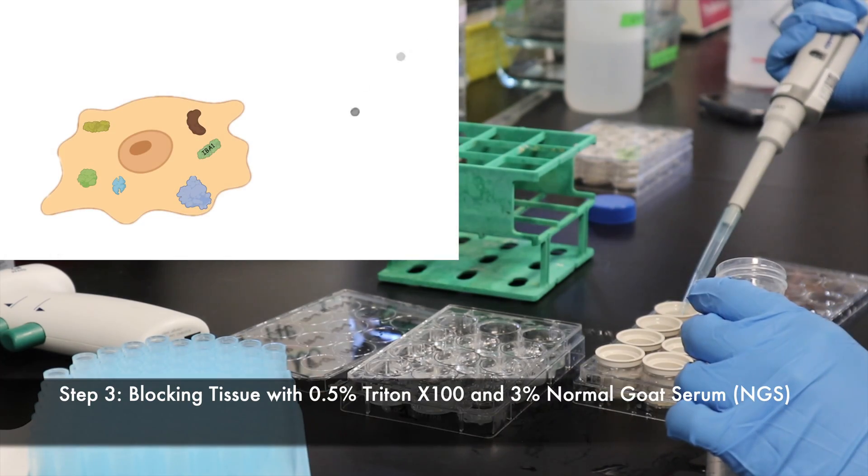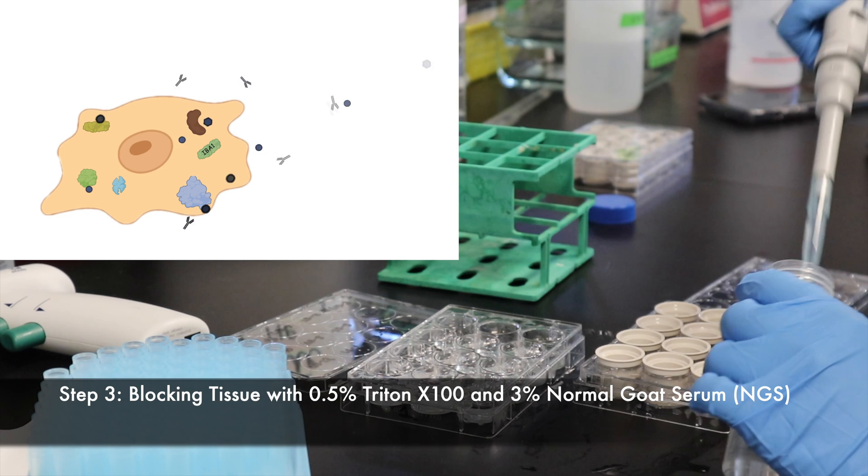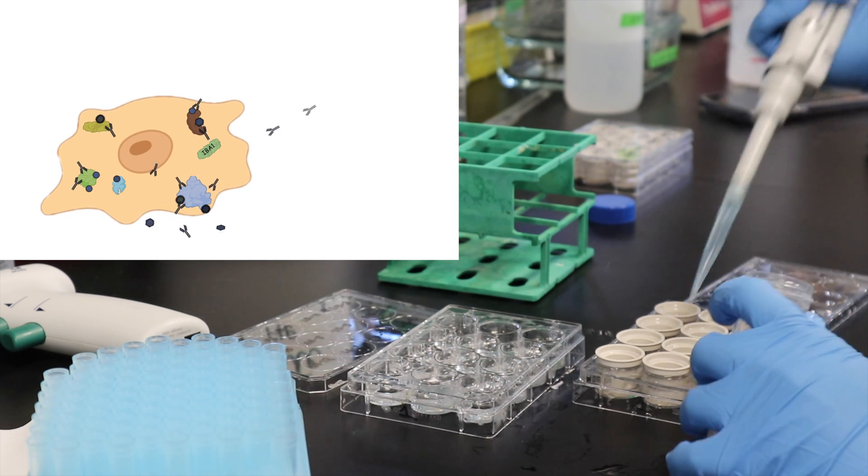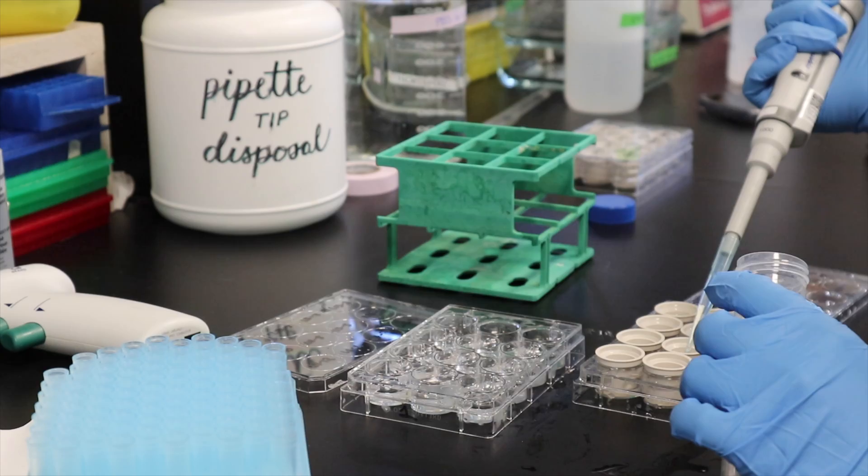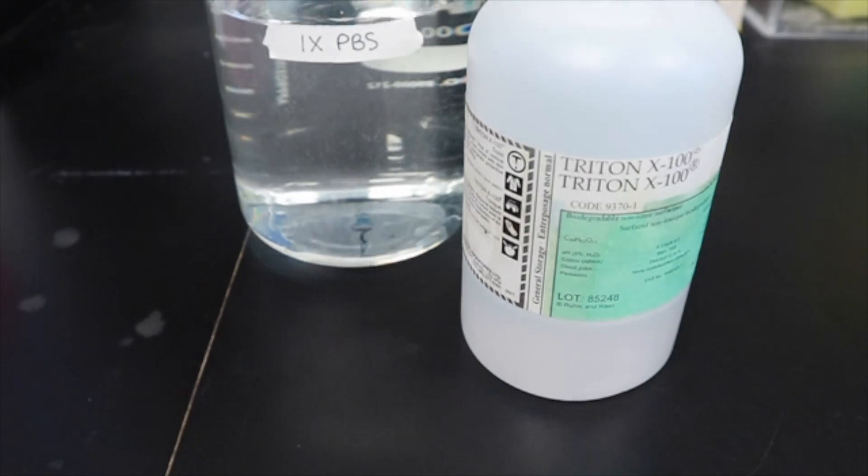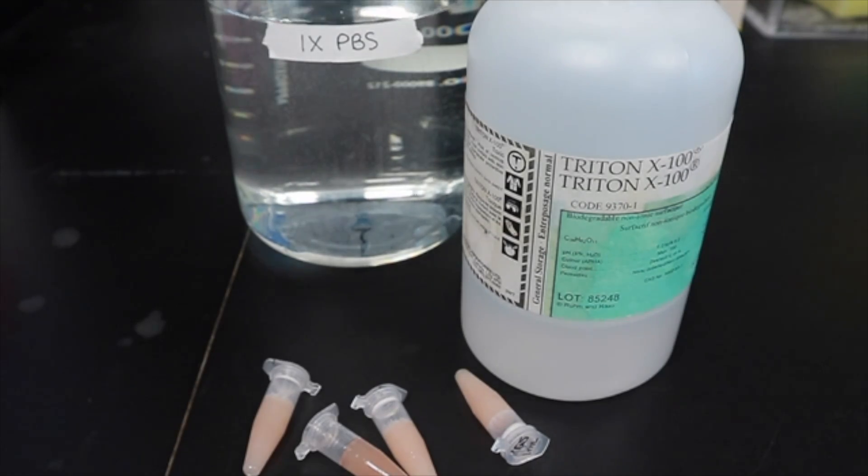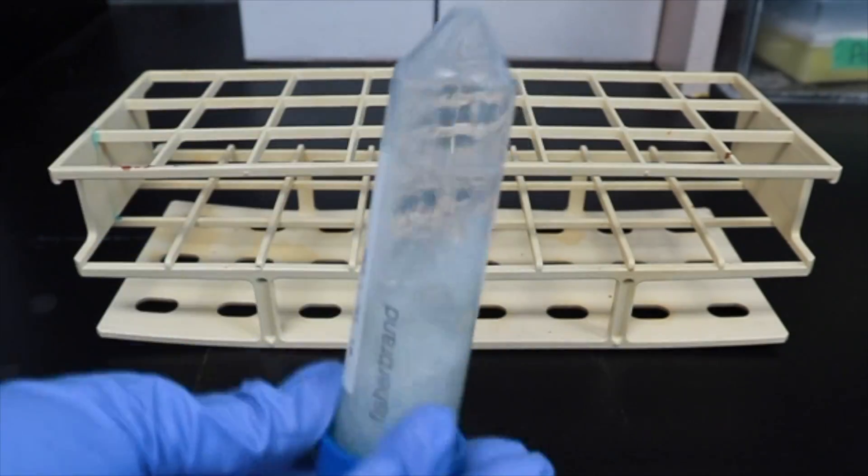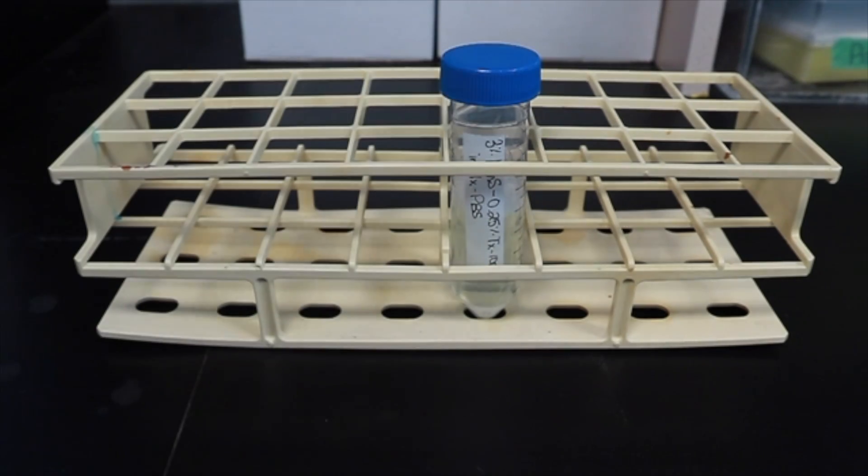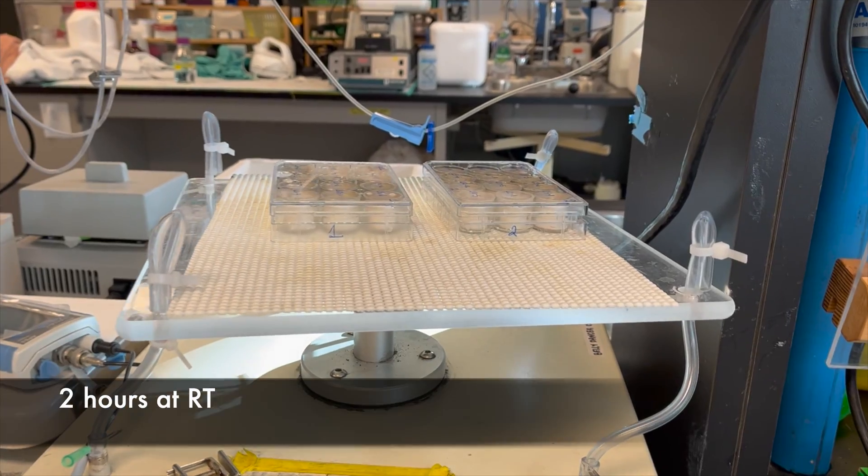In this next step, we will be adding approximately 2 milliliters of blocking buffer to each well in order to prevent nonspecific binding of the primary antibody. To make the blocking buffer, you will need 500 milliliters of 1X PBS for dilution, 0.5% Triton X, which will act as a detergent to increase cell permeability, and 3% normal goat serum to reduce noise caused by nonspecific binding of antibodies. Make sure to mix your solution well by inversion, and once added to your tissue, incubate plates at room temperature for 2 hours.